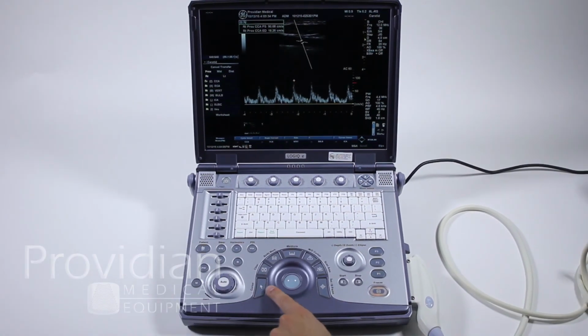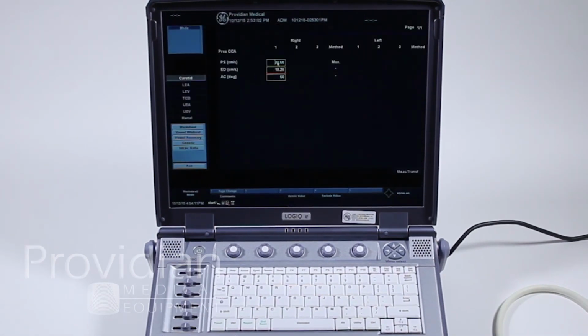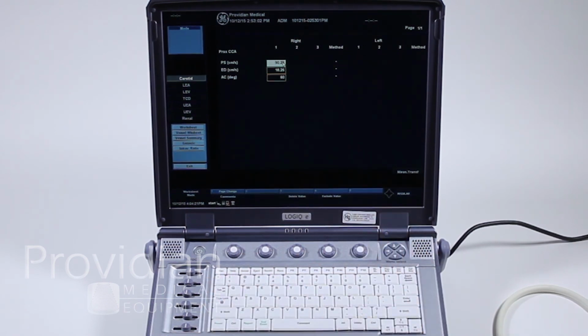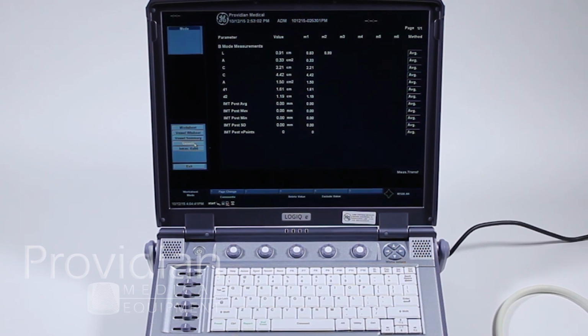So we'll show the worksheet here by pressing the cursor button, clicking on Worksheet, and here it shows the measurements we've made. Notice it turns green, it means I can click in there and make an edit to that measurement. Backspace, and if I change that measurement and leave it, it's going to show an asterisk showing that this measurement was edited by the user. We can also show all the generic measurements we made, just showing length. It doesn't really give you any information, so normally when you make a generic measurement with no calculation assigned, it's something that you would print with a label on screen.